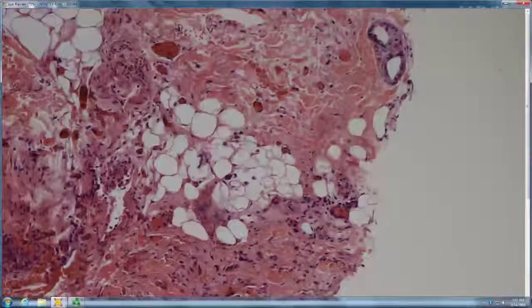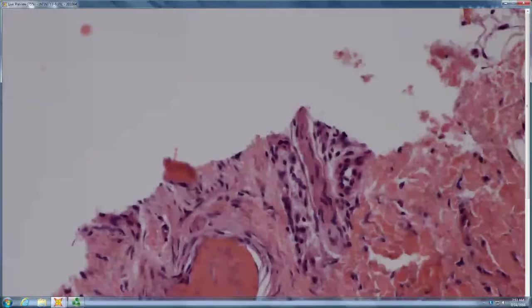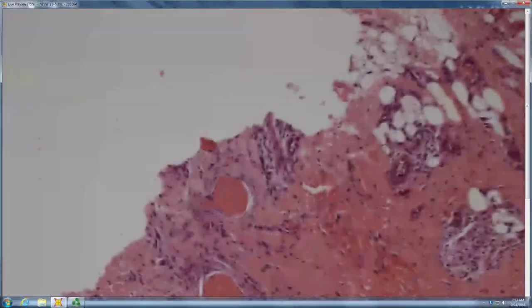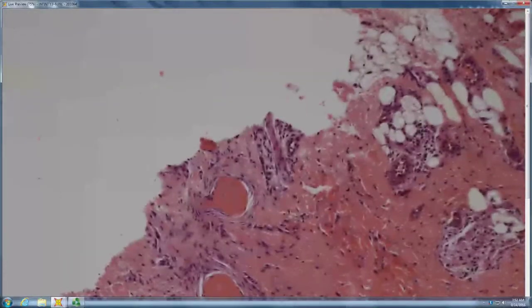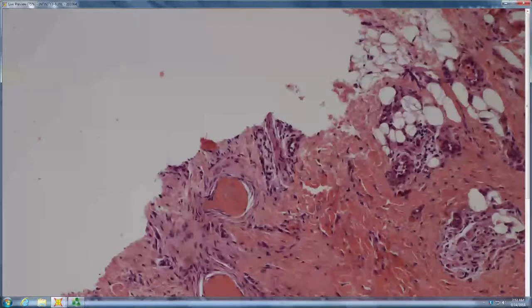A little deeper. Those lollipop bodies are going to say NSF, and then the neutrophils, I don't know what that's all about. But there may have been some ulceration or something adjacent that gave it that. But busy dermis, and it's bottom heavy.